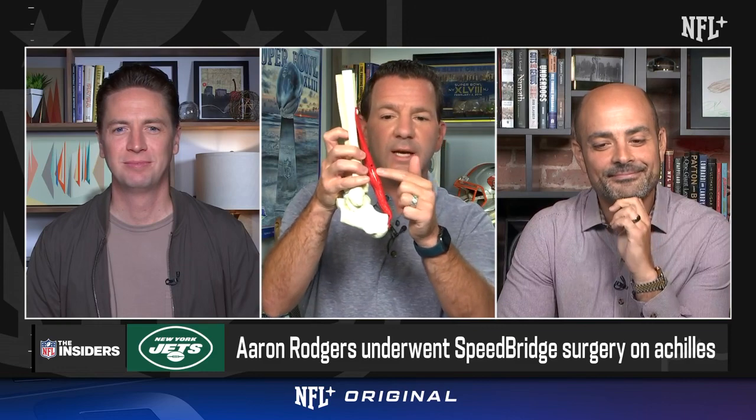So the Achilles mid-substance speed bridge is the entire construct — it's the sutures, it's the swivel locks — and it's basically to bracket it and make sure it's as supported as possible, which you can sort of see on the side here.